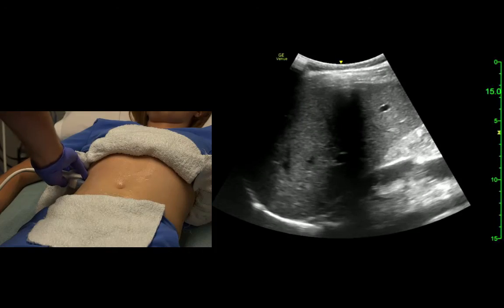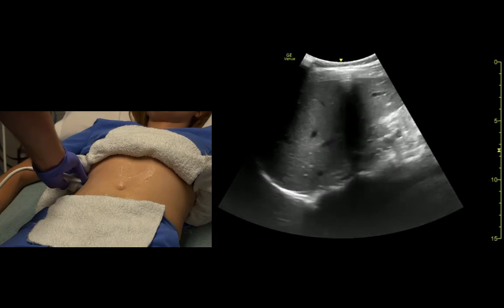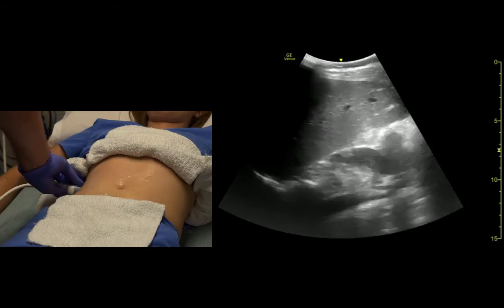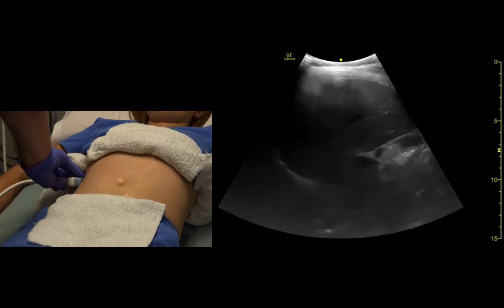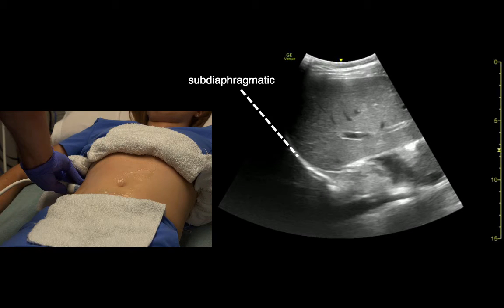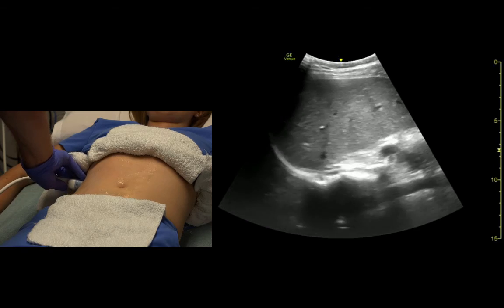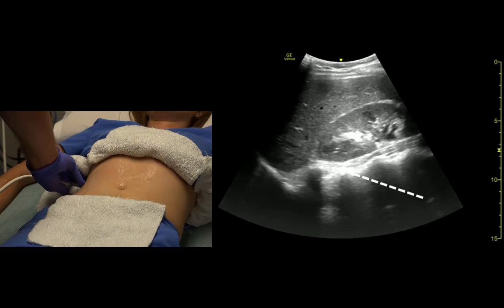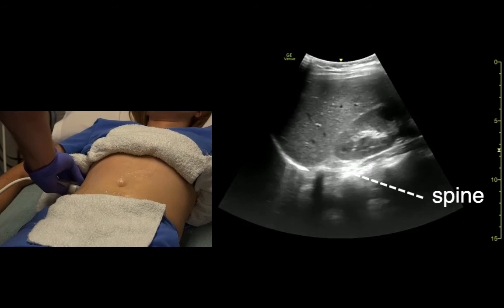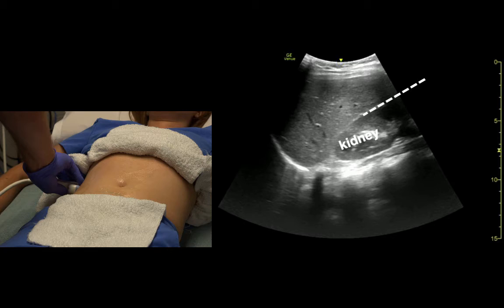We'll point out the potential spaces again: the sub-diaphragmatic space, and we see the spine — the spine should stop at the diaphragm — then the kidney, and Morrison's pouch.